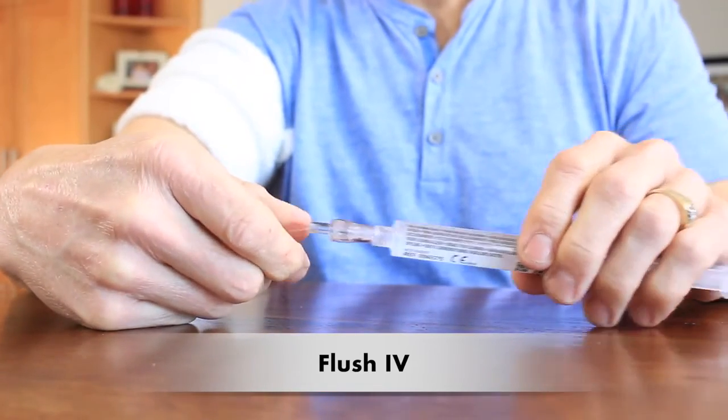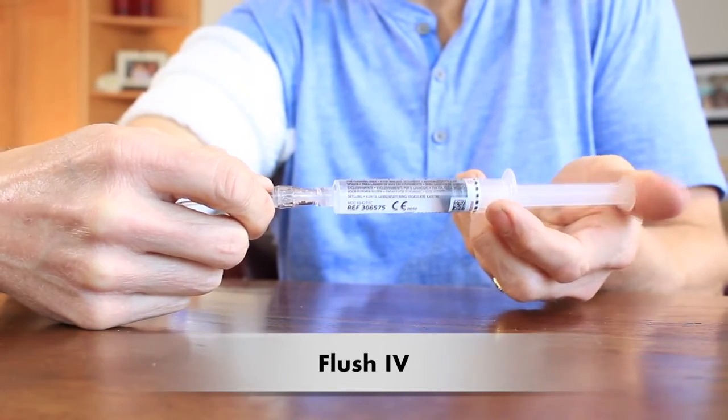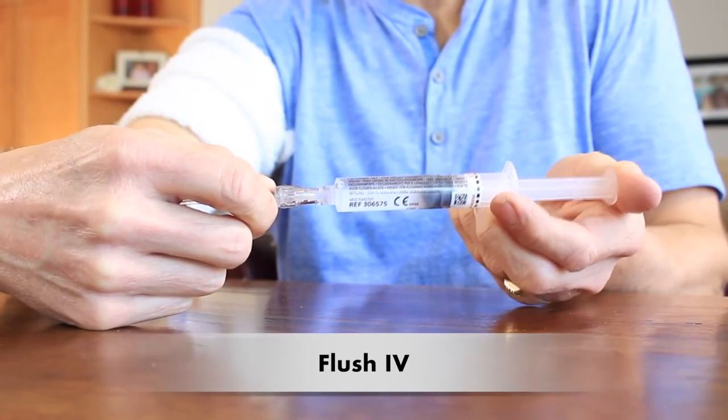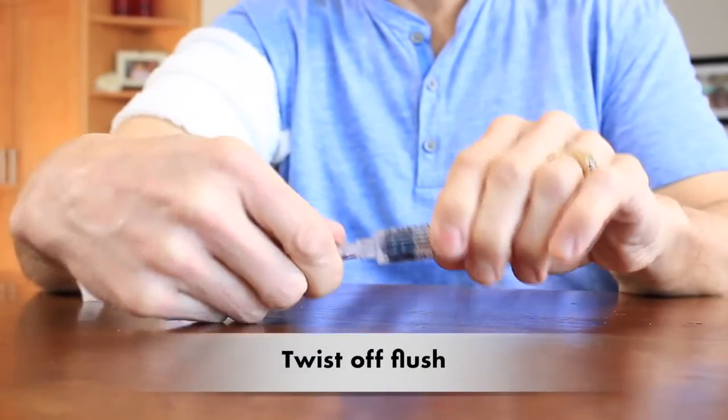And now you're ready to push on the plunger. Push, stop, push, stop, push, stop, push, stop. Twist off and your IV is now clean.